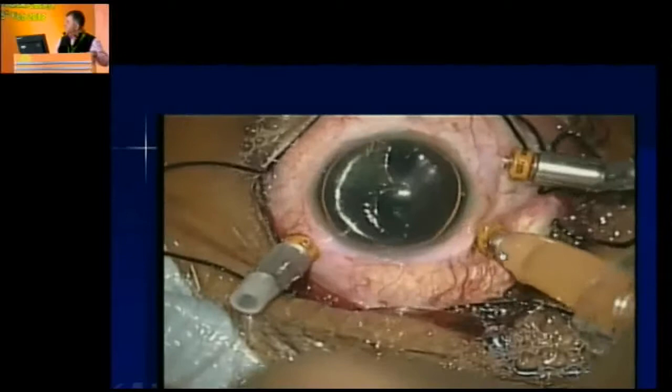Here, for this particular giant tear, the laser couldn't come there. I had to do cryo because it was still standing like a stiff thing up. So that's how this was cryoed. And subsequently, silicone oil was injected in this eye.